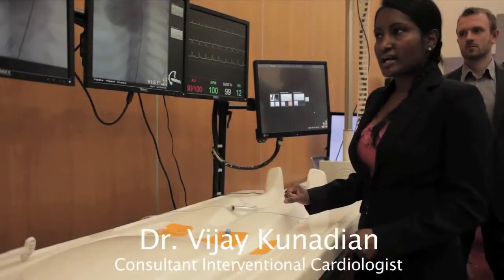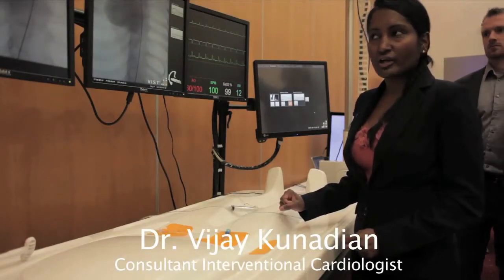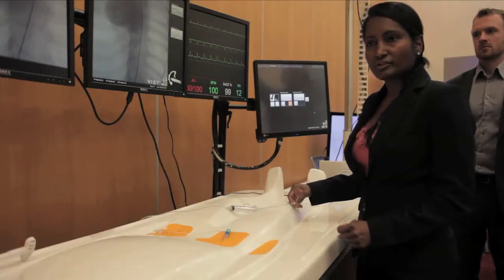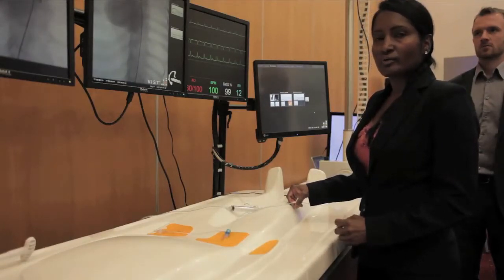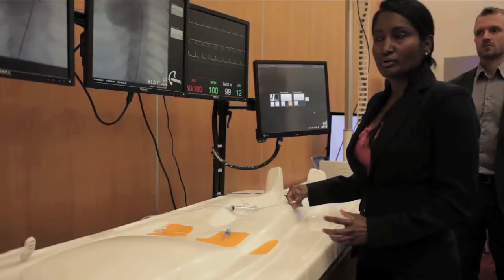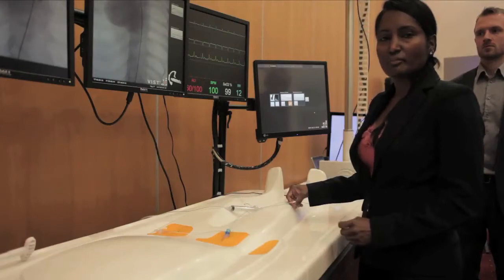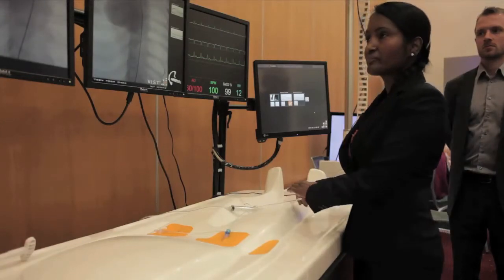I'm now going to demonstrate how to engage into the right coronary artery. It is exactly the same step as we did for the left coronary engagement. The right coronary artery arises from the right coronary sinus in most cases, so we use a Judkins right catheter, which is the commonly used catheter to engage into the right coronary artery.